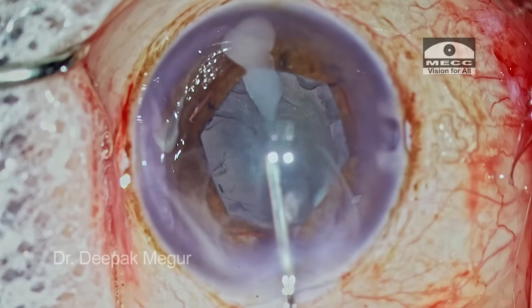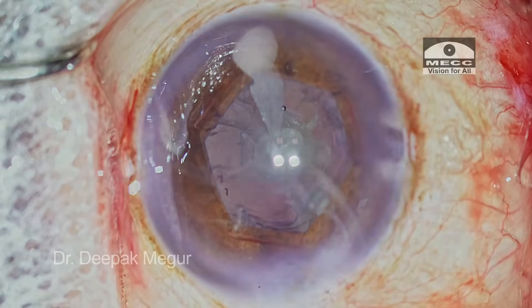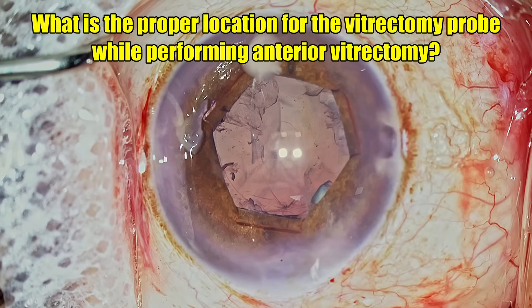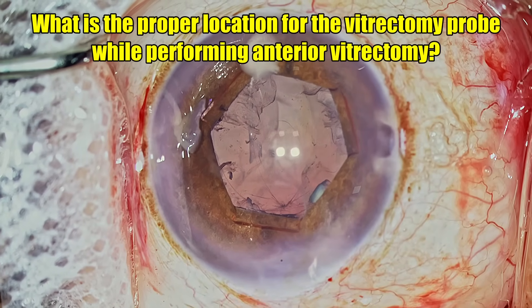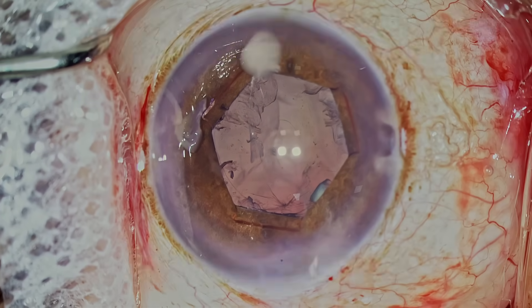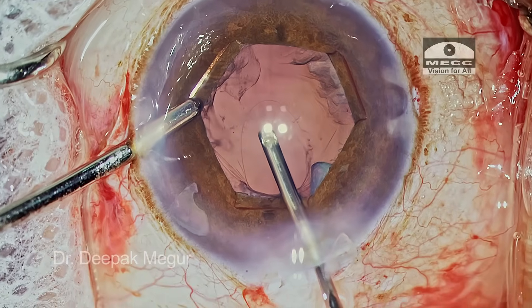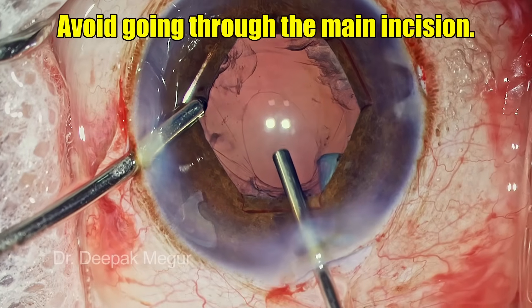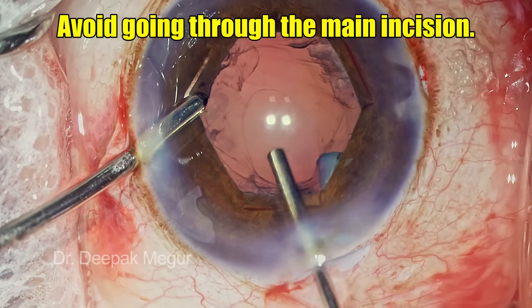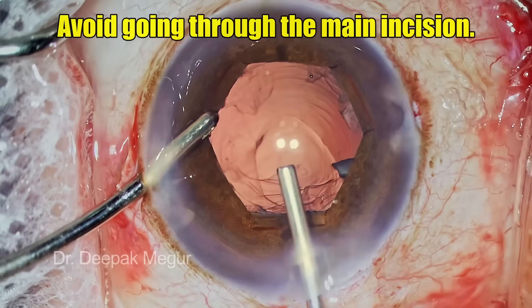The surgeon has put in some triamcinolone acetonide just to identify the vitreous prolapse, and at one end we can see the vitreous tugging at it. To do bimanual anterior vitrectomy, where should our vitrectomy probe be — through the main incision or through the side port? Always remember it is preferable to have a closed chamber while performing anterior vitrectomy. If we have a leaky wound, there is always a risk of more vitreous prolapsing out. So always ensure that we use a closed chamber technique and avoid using the main incision.